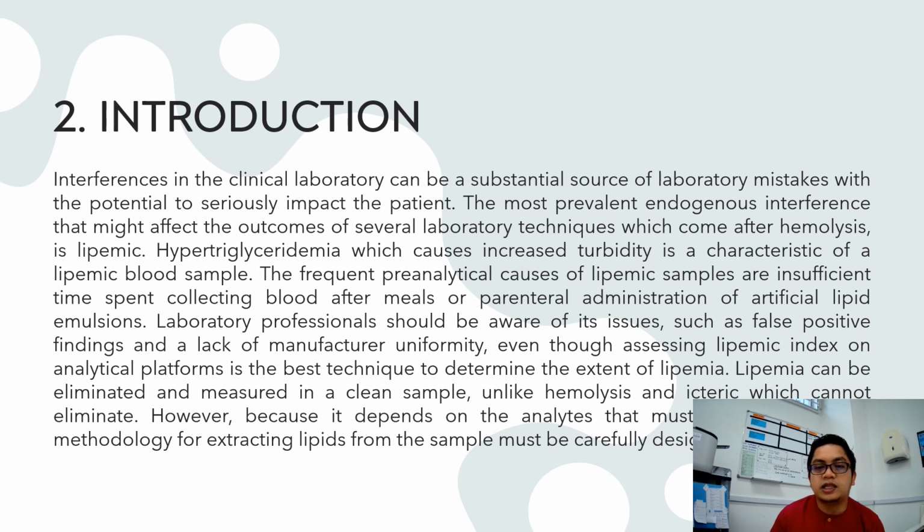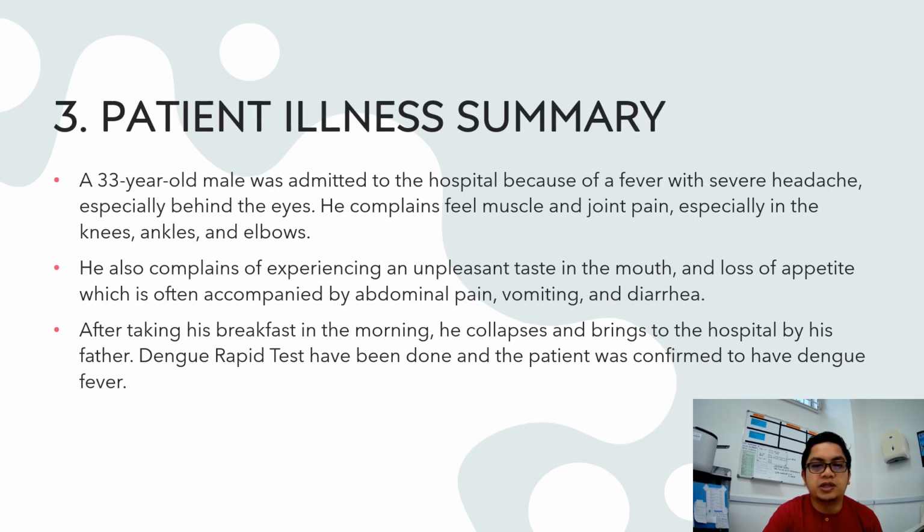Even though assessing the lipemic index on an analytical platform is the best technique to determine the extent of lipemia, lipemia can be eliminated and measured in a clean sample, unlike hemolysis and icteric, which cannot be eliminated. However, because it depends on the analyte that must be identified, the methodology for extracting lipid from the sample must be carefully designed. This is a patient illness summary of the case study.